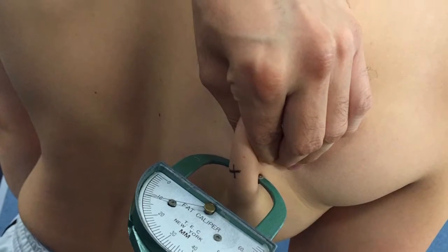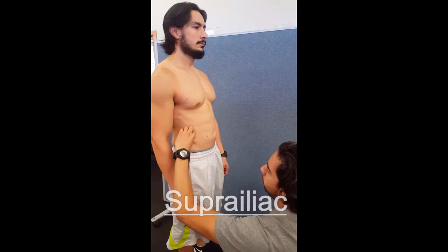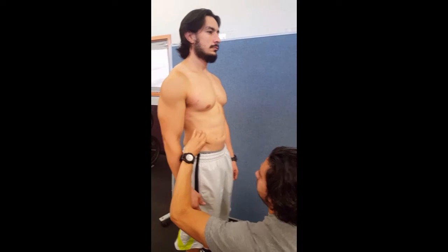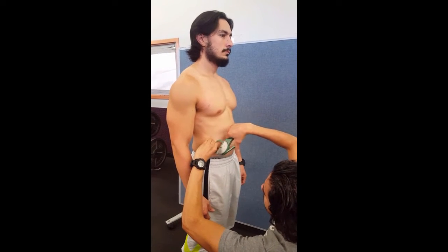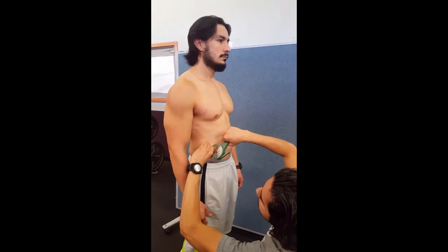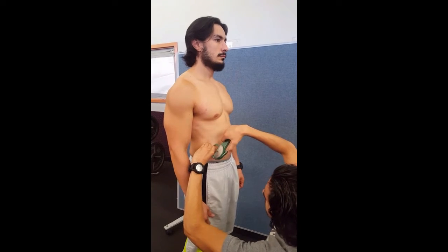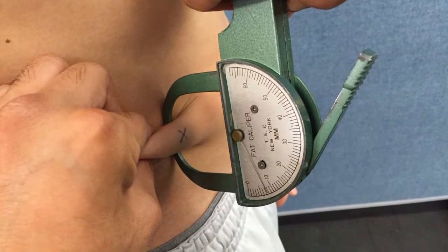Following the subscapular, we proceed with the suprailiac. It is a diagonal fold in line with the natural angle of the iliac crest, taking the anterior axillary line immediately superior to the iliac crest.